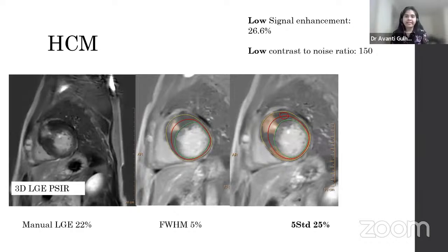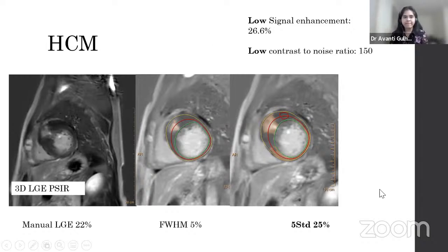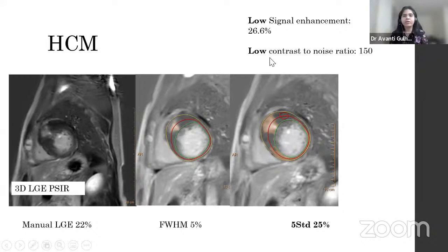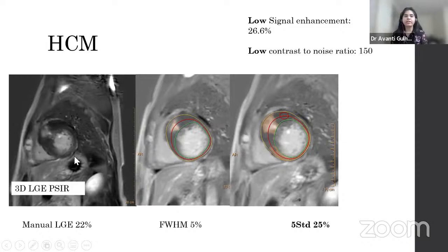In our cases, we analyzed fibrosis in ischemic and non-ischemic patients. In a patient with hypertrophic cardiomyopathy, we found a low contrast-to-noise ratio and low signal enhancement percentage. In this patient, 5 SD was closer to manual quantification of the scar, while full width at half maximum underestimated the scar.